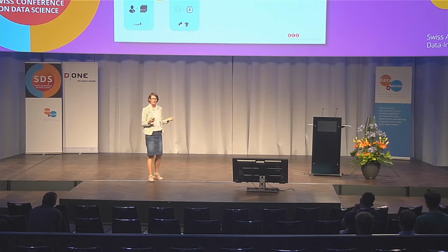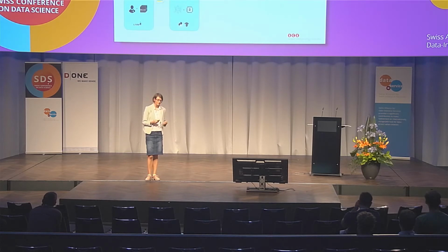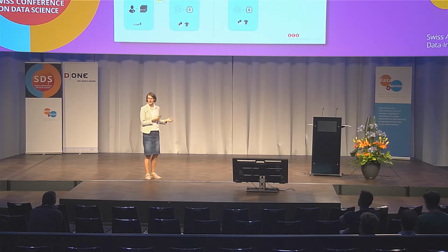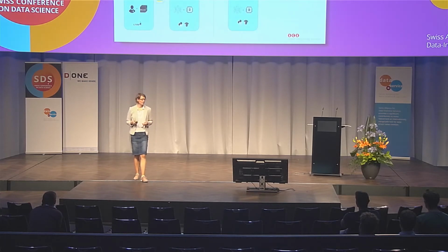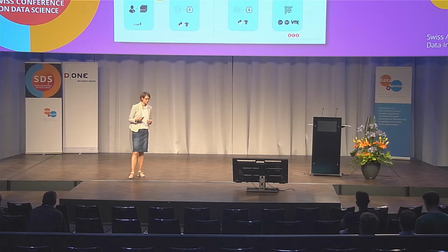Now, once we had folded our paper plane, we wanted to make it a real plane and make it available to the people. And for this, we mainly performed 2 essential steps. The first step is that we had to decouple our components. We had the training phase, and there we extracted our CNN model and used it only for the prediction. And then new data could be inserted into this predictor, and it would generate us the segmentation.